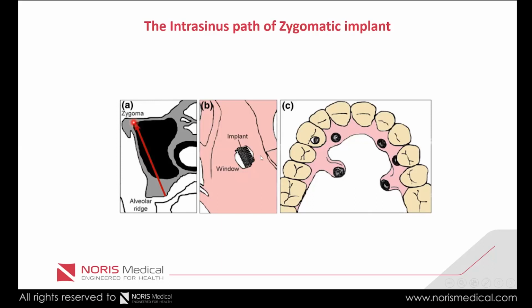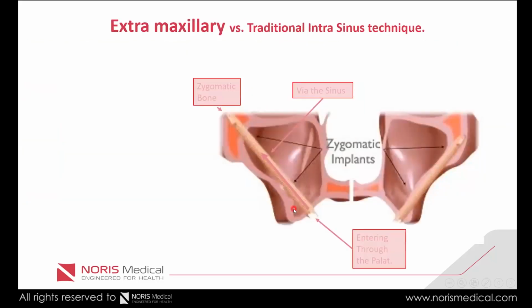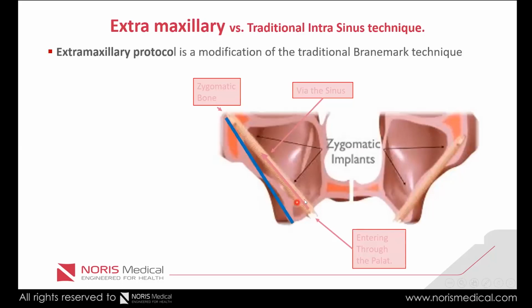It's not easy. And because the implant is positioned on the palate, the position on the palate is like that, which is very complicated for the restoration. Okay, the restoration would look like that. So not very friendly.